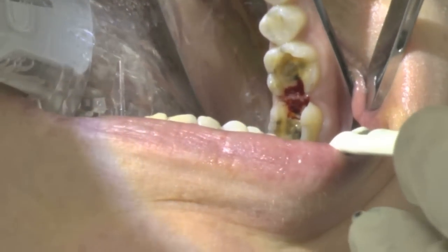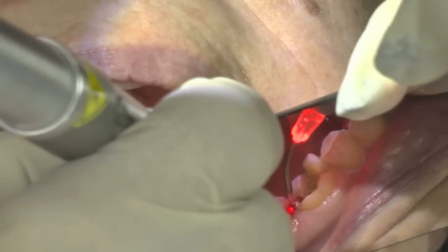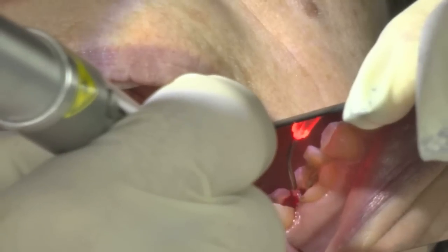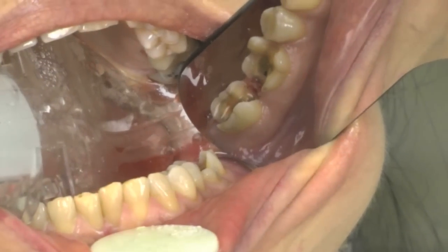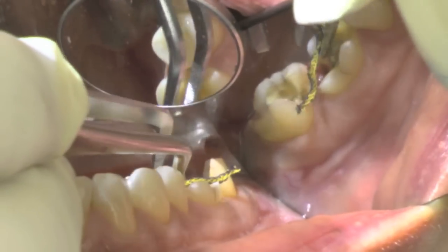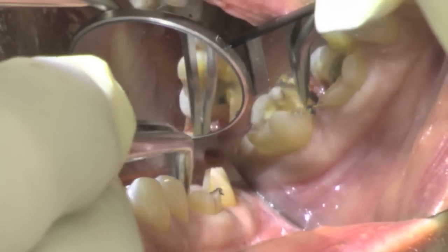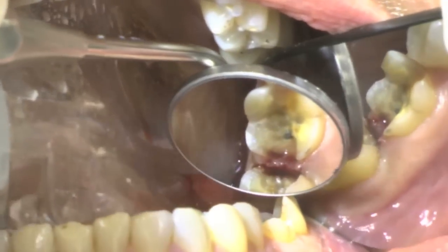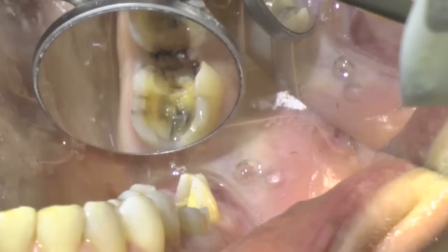These margins ended up subgingival, and our patient is on Coumadin, so isolation is very important. We use the laser. It gets us most of the way, and then we'll pack some cord and really isolate those margins very nicely. Ideally, we'd like supragingival margins, but that's not always possible. So when the margins are subgingival, it's important that we can define them, isolate them, so that we can scan them, and more importantly, be able to achieve isolation at the margin for bonding.